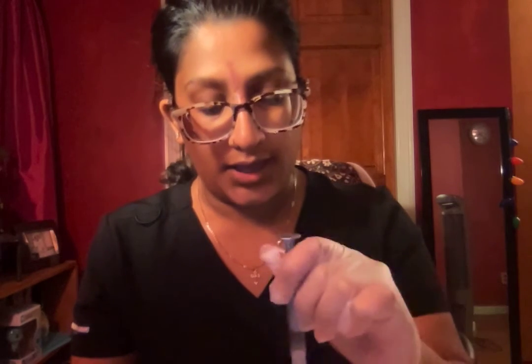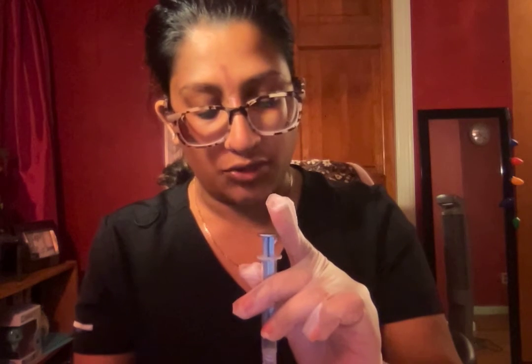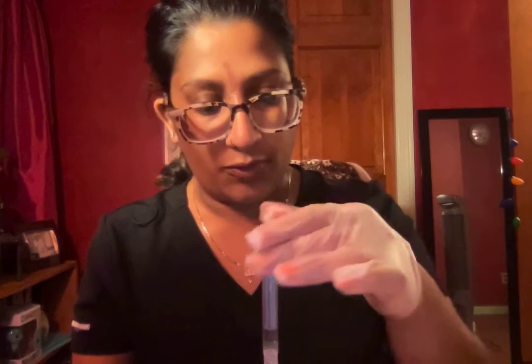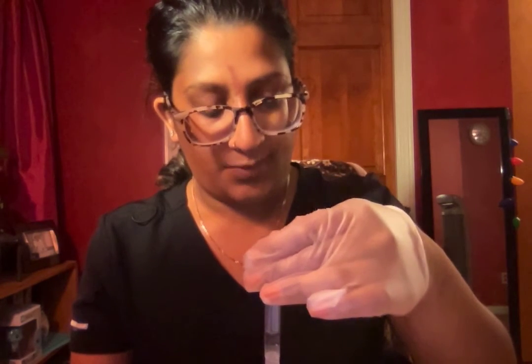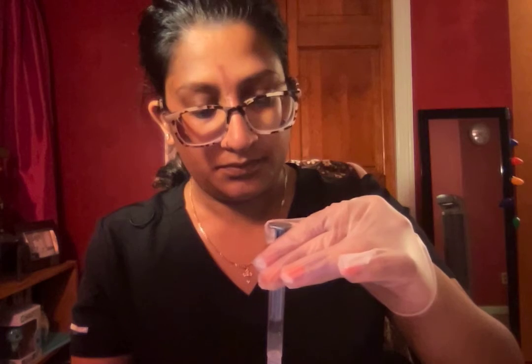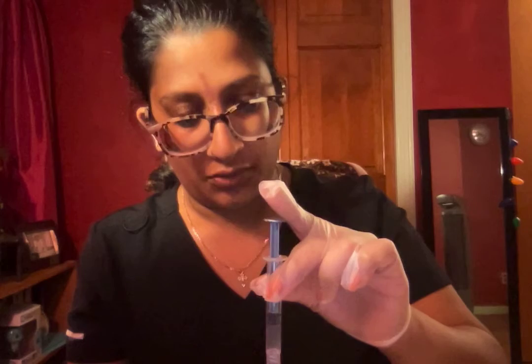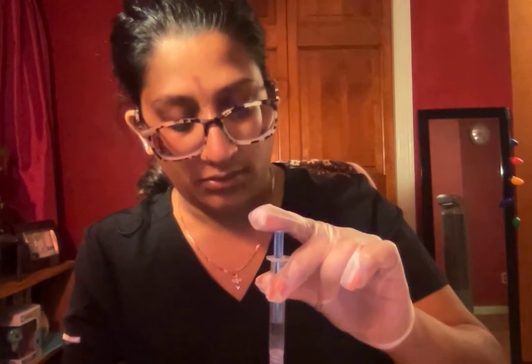Like that. I'm going to insert this needle. I'm going to open it up. I'm going to insert it on a 90-degree angle. So like this. And I'm going to hold, stabilize the needle. And I'm going to aspirate back the plunger for 3 to 5 seconds. And if there's no blood return, which there's no blood return, I'm going to inject the medication like this.